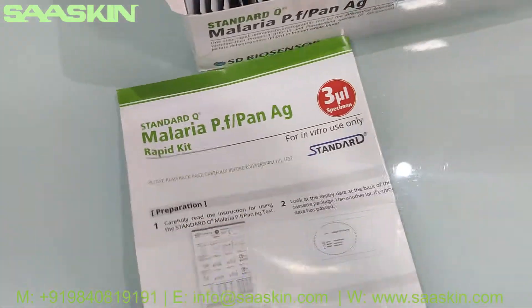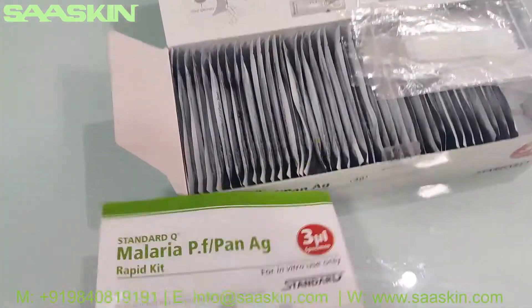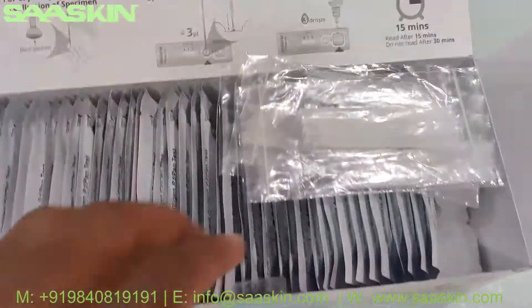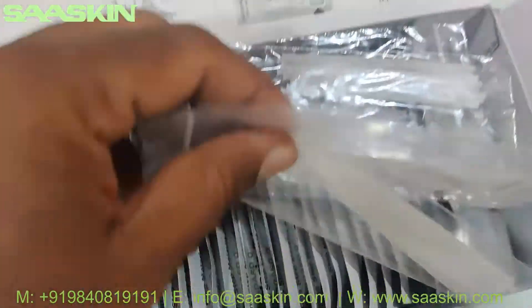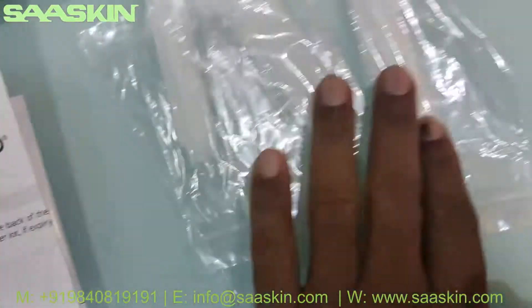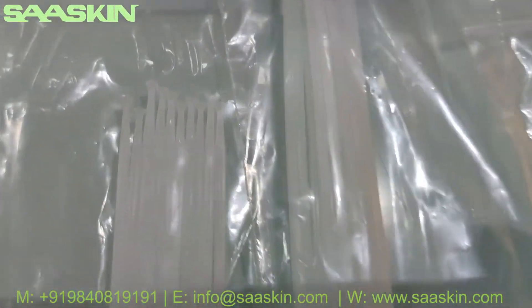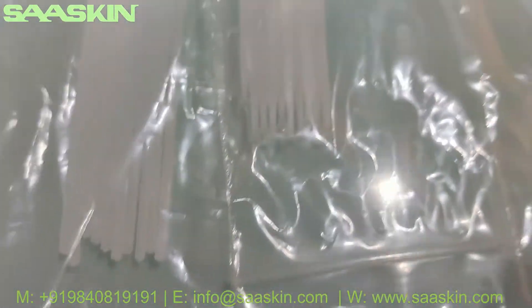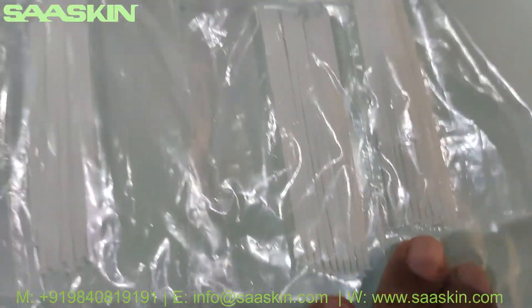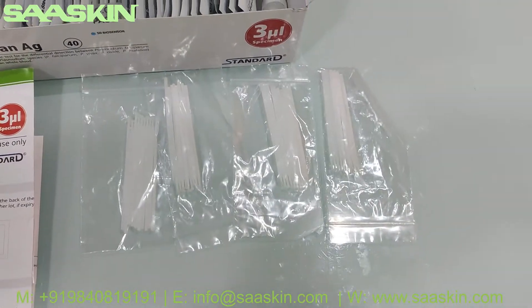You have got an instruction manual, and you have got 4 packs of specimen transfer devices — each pack has 10 pieces, so you have got 40 in total. You can see how the specimen transfer device looks like — 4 packs.